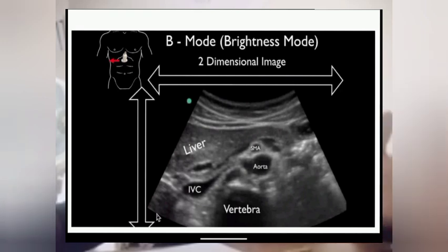Once all the echo data for a complete image has been stored in memory, the data is read and goes straight to your display. And on your display, remember, there are shades of gray. Strong echoes are white, mid-level echoes are gray, and very weak echoes are almost black. Where there is blackness, or complete zero echo, it means that there is no echo returning, so there is nothing there to reflect.